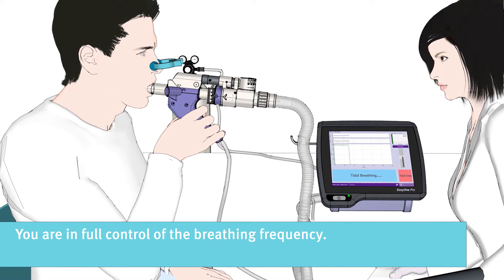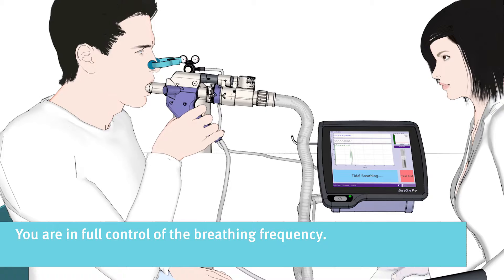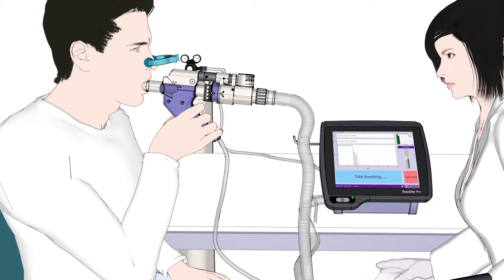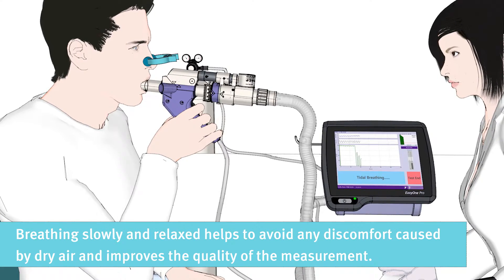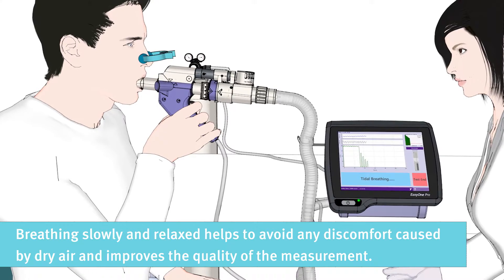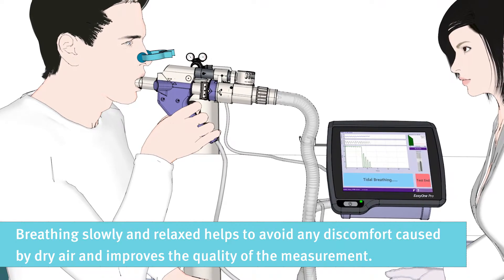You are in full control of the breathing frequency. Breathing slowly and relaxed helps to avoid any discomfort caused by dry air and improves the quality of the measurement.